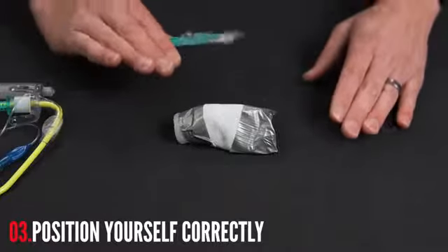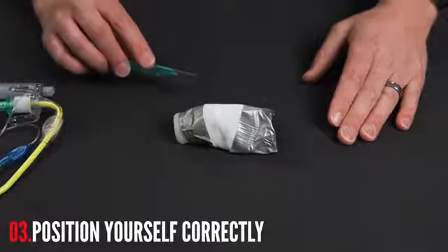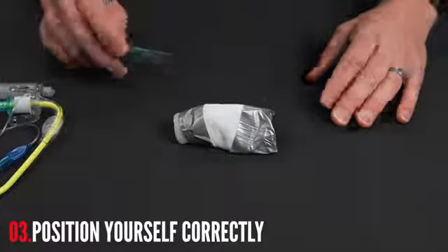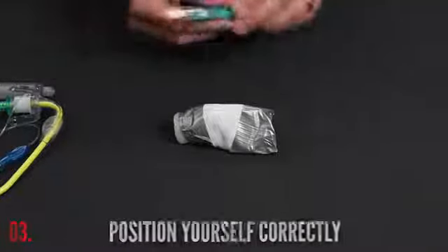So if I am right-handed, I need to make sure I'm able to hold the scalpel in the right hand, and I'm going to position myself on the right side of the patient. If I'm left-handed, same thing. We're going to go to the left side of the patient.